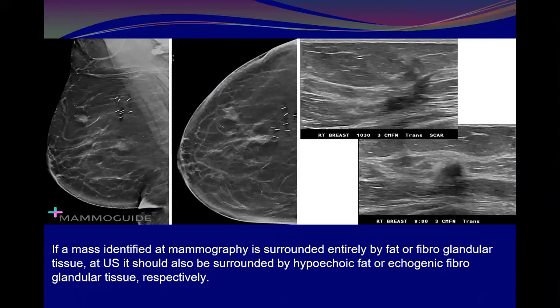Again, this is the fatty breast, and here this is a breast lesion. But good, we have a CC view. So this lesion is central and this one is upper. Here both, this is central, so this is most likely at 9, and this one is a little bit more lateral, and upper, at about 10 o'clock.